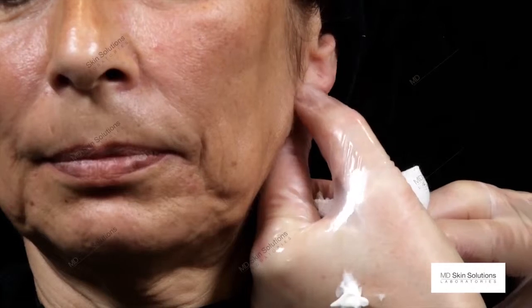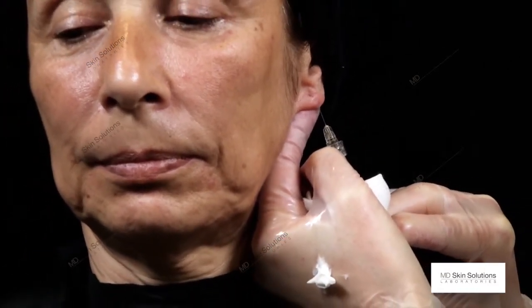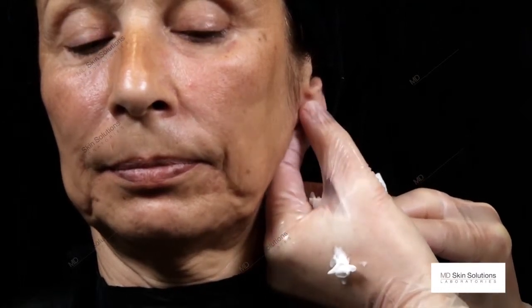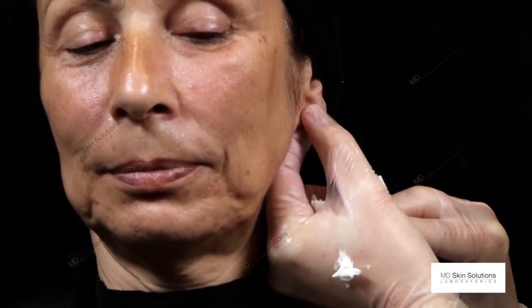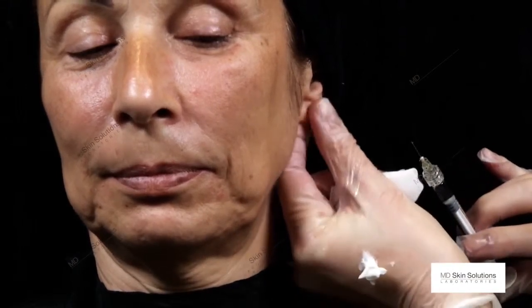Don't do many entry points because earlobes do bruise a lot. Now I use 0.4 of Pluryal in both sides.